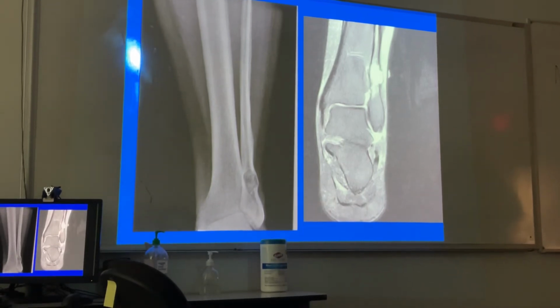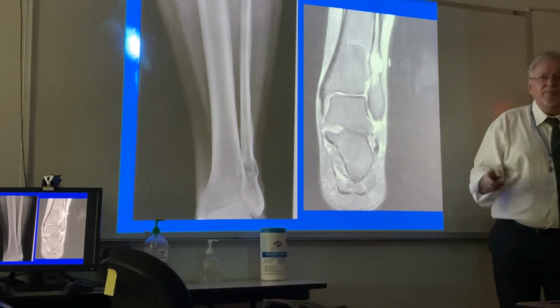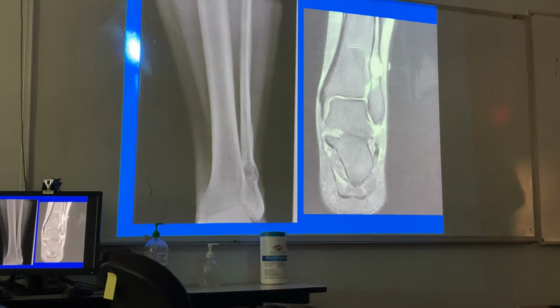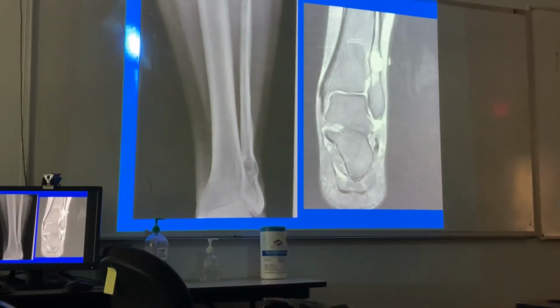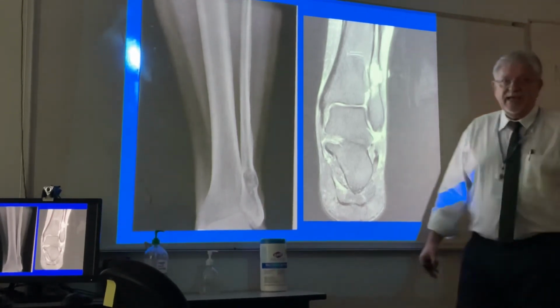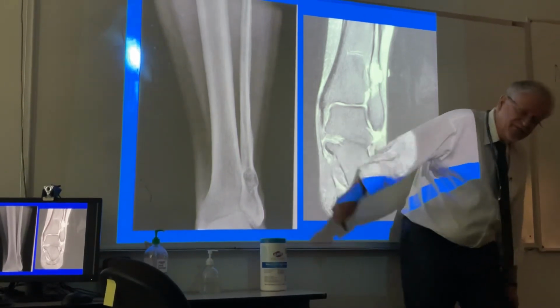Body part? Tib-fib. Now, there is no marker, so we assume anatomic position, yes? And in anatomic position, this is? The left one. Oh, that's the right one. In anatomic position, where's my fibula? On the right. Lateral. Okay, so which one is this? If you were facing it, your fibula's on the outside. In anatomic position, where's my fibula? On the left side. This is the left leg.